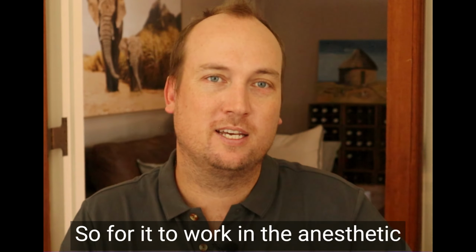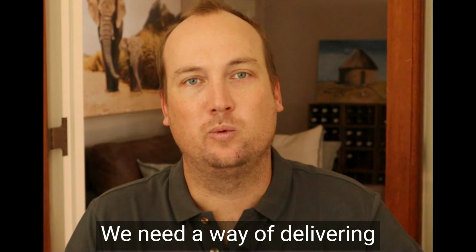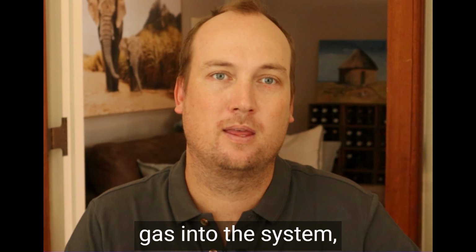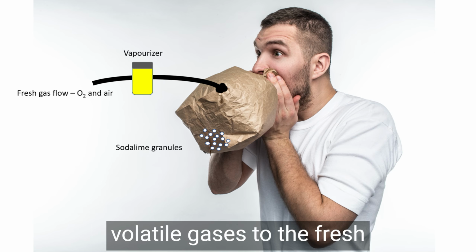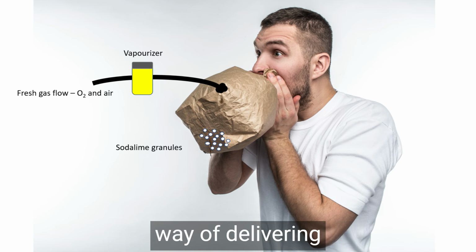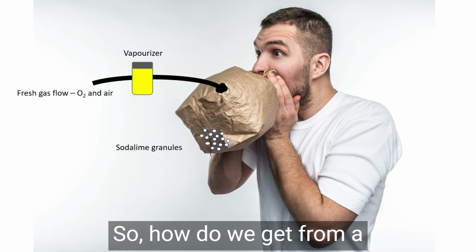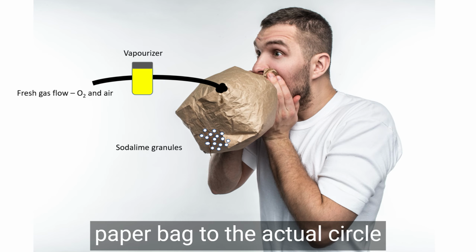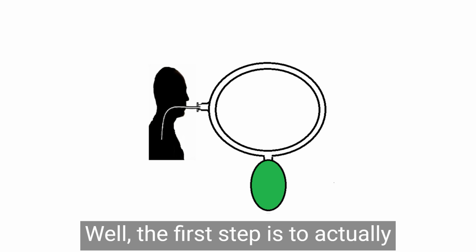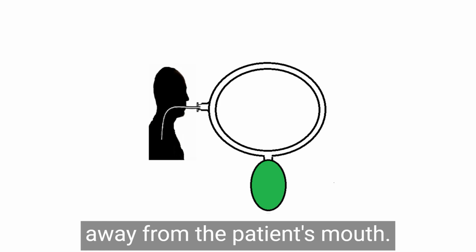So for it to work in the anesthetic scenario, though, we do have to have a few extra components. We need a way of delivering our volatile anesthetic gases into the system. And we do this by adding the volatile gases to the fresh gas flow of oxygen and air. So that's the perfect way of delivering volatiles into the system. So how do we get from a patient rebreathing air in a brown paper bag to the actual circle system we use in anesthesia? Well, the first step is to introduce a circle of breathing tubing and to move the bag away from the patient's mouth.